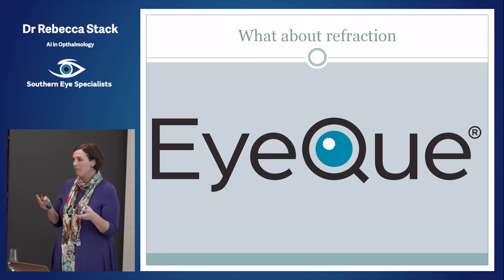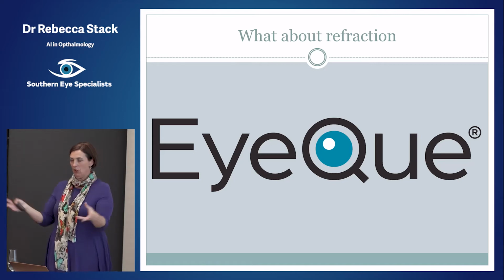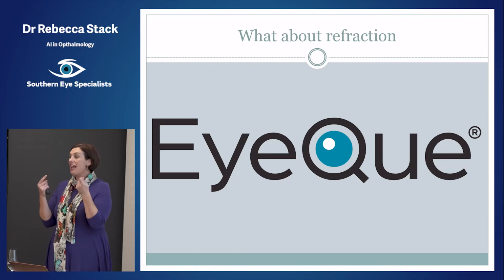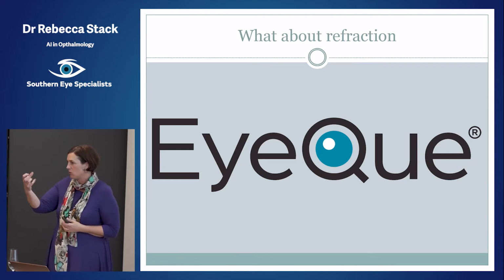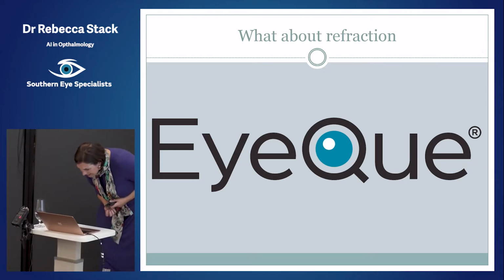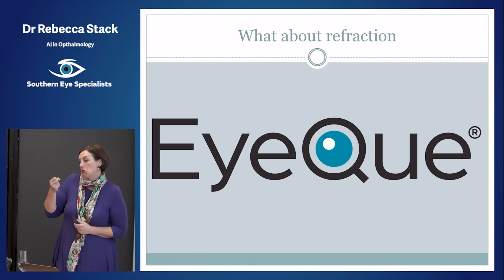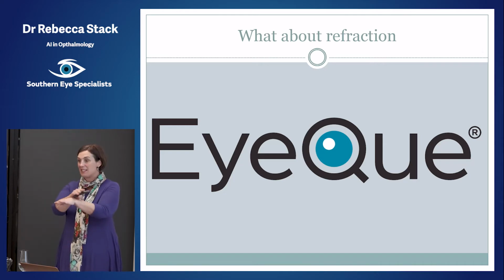So you sit at home and you download this app, you load it up into the system and you look at these various things on the screen, and the computer analyzes your eye movements and the shape of your eye and somehow does something clever. By the way, you buy this special other device thing. Can't remember what it's called. Something that you've got to buy as well that must do something too, some kind of mini refractor thing that you hold up. And you do all these tests, and when it's stable and accurate, it spits out a refraction for you.